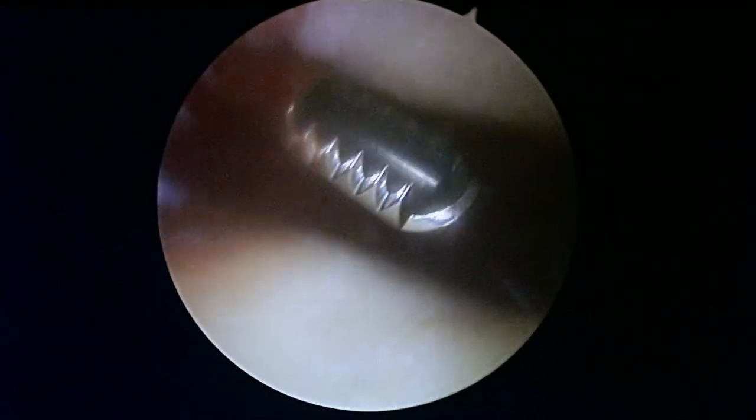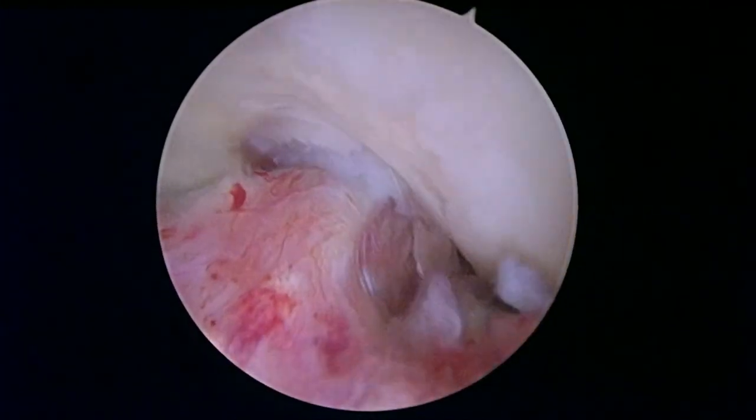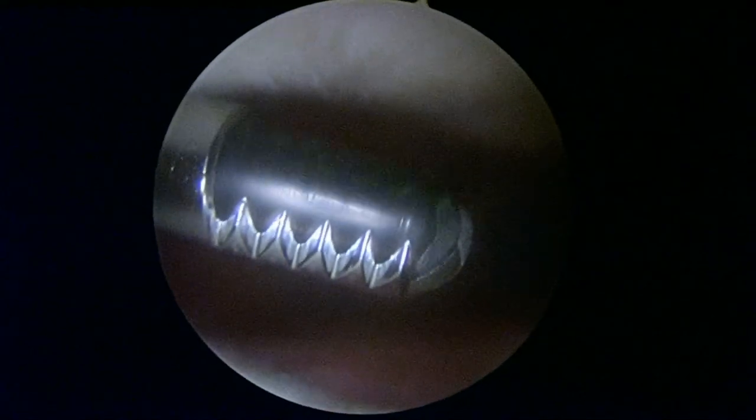Now we're looking up in the patellofemoral region — there's your patella or kneecap at the top of the screen — and all the way down to the front of the knee, that looks all right. We're going to keep working here. I think this will be the actual end of the entire video because we're just about done on this left knee. If there's anything else interesting or significant we have to do, we'll come back up on the video and show you — but otherwise, good luck to you. Bye-bye.